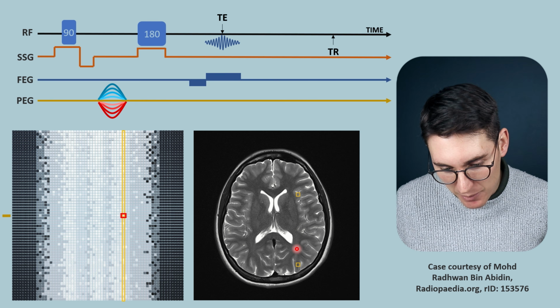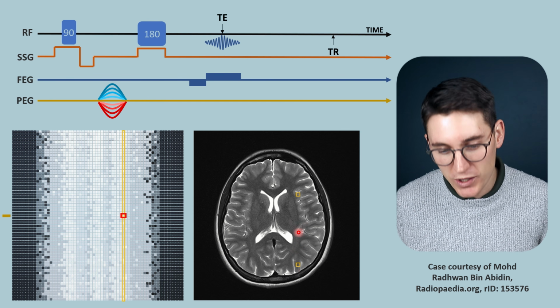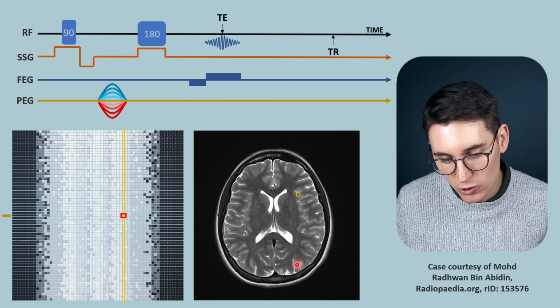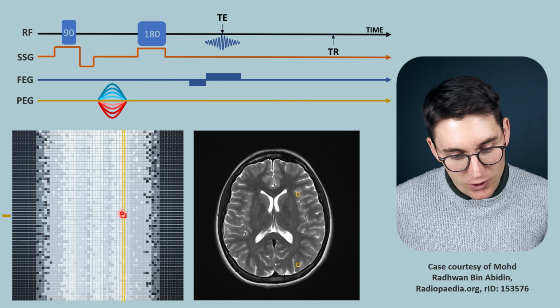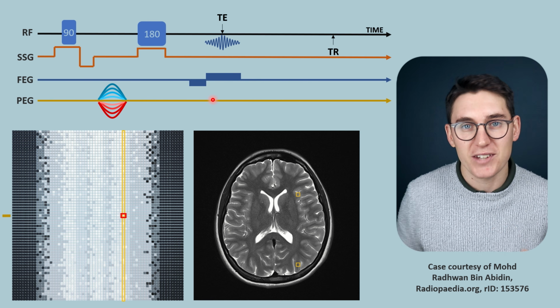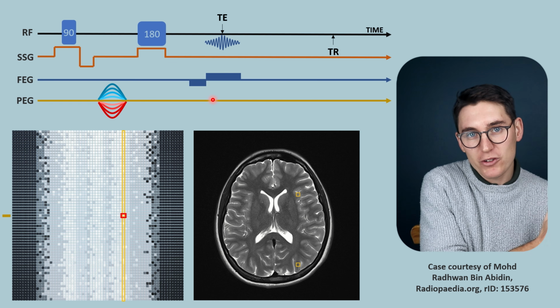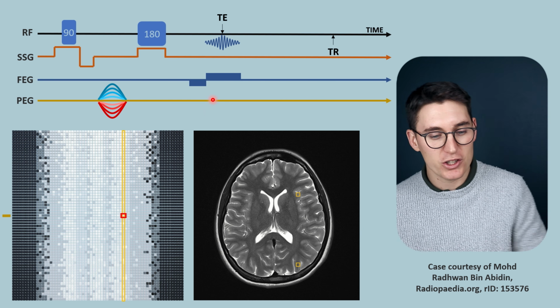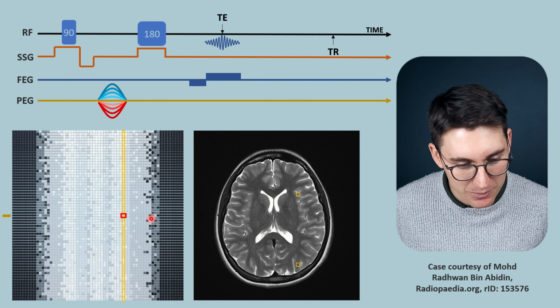Now that signal coming from the x-axis column on our image, we're making the assumption that that signal is only coming from these 2 pixels of interest. It also represents the signal that is coming over the entire period of data acquisition time. Remember, we've used all of that data that we generated in K-space to Fourier transform and create this frequency-based location here.